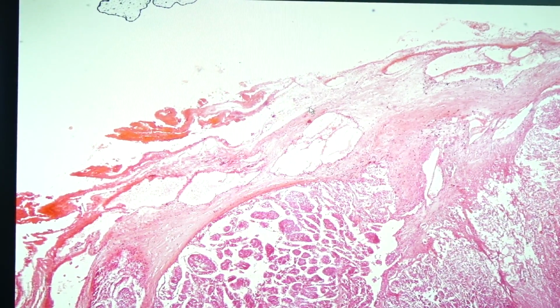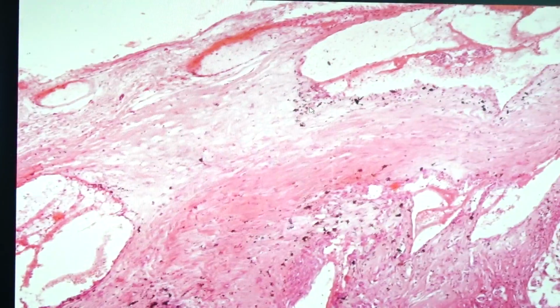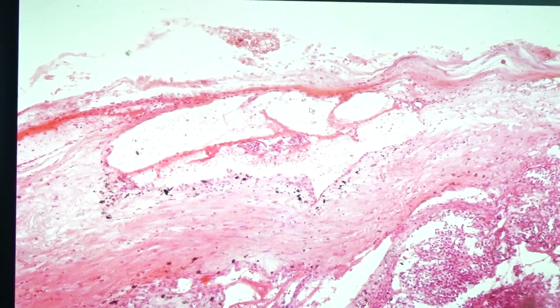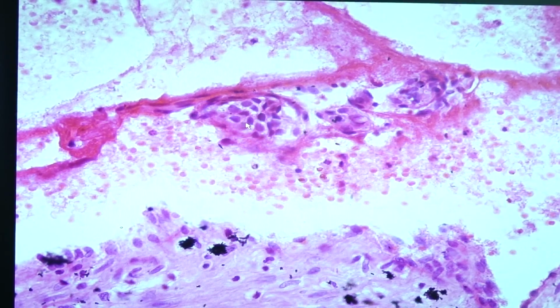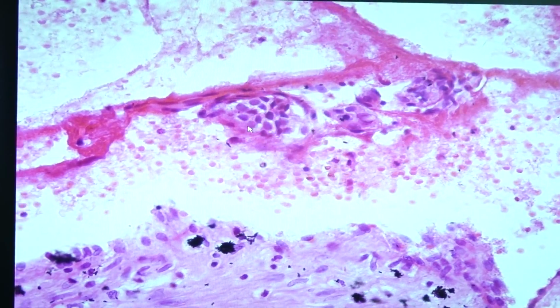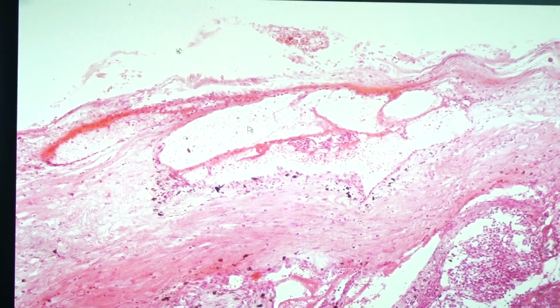So you look for presence of thyrocytes within the lumen. There, you would see the presence of a thyrocyte follicle or cluster in the lumen. This is a sign of vascular invasion. So capsular and vascular invasion would be the criteria for follicular carcinoma.